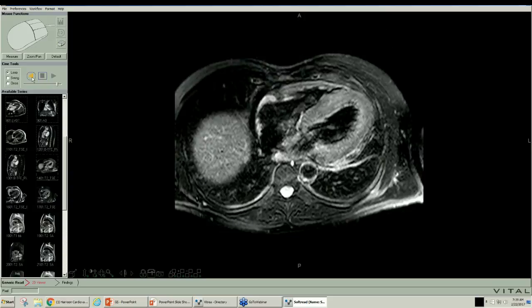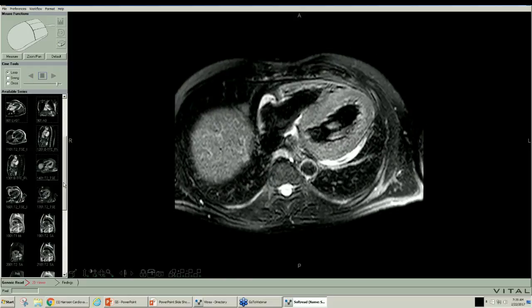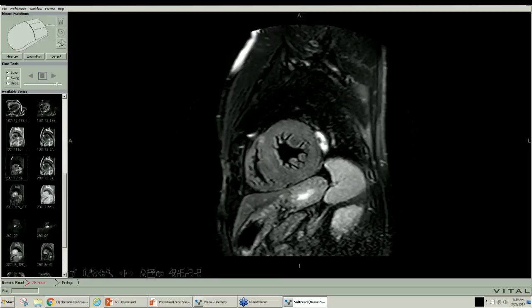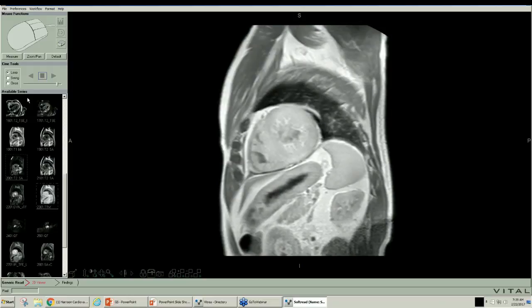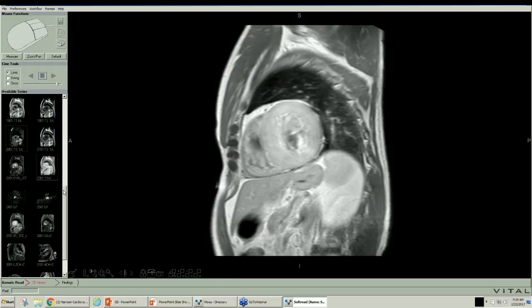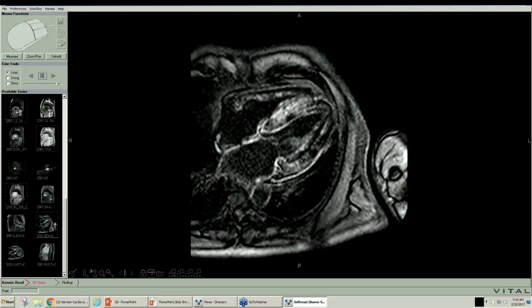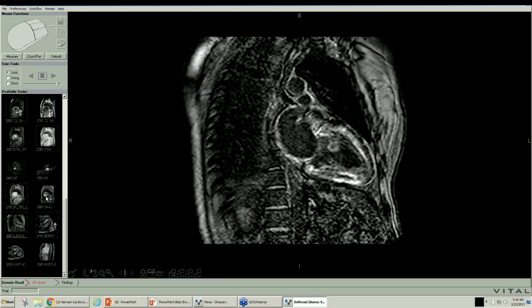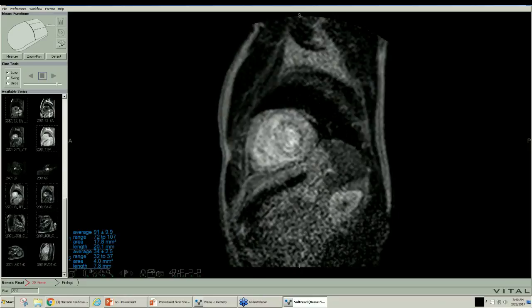And here we go, probably looking at T2-weighted, and then no edema, same there. Looks like a contrast study, right? Not a contrast study. It's T1-weighted. And so we get these pictures, try to null it, and let's see the success rate of nulling it.